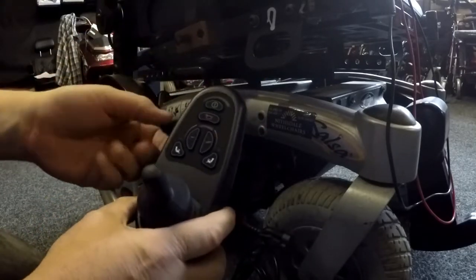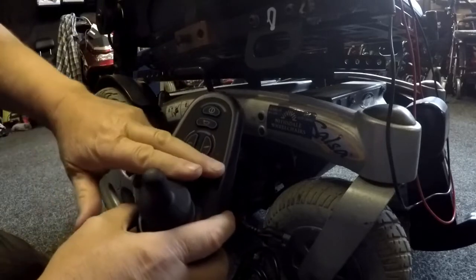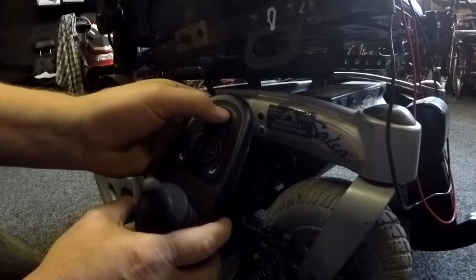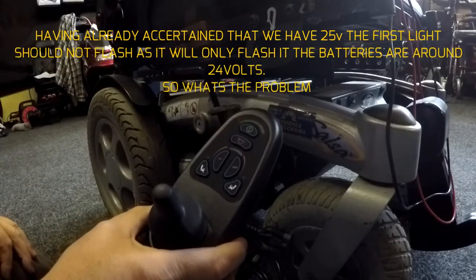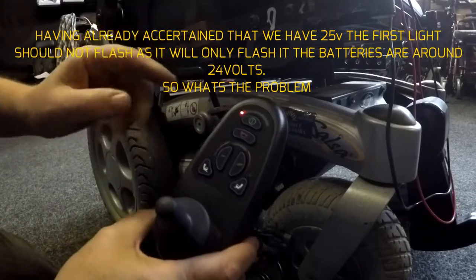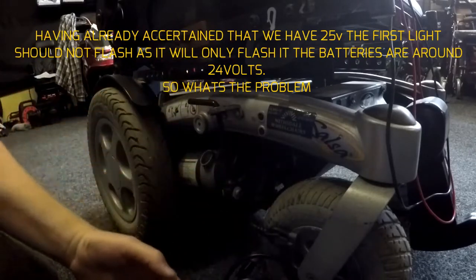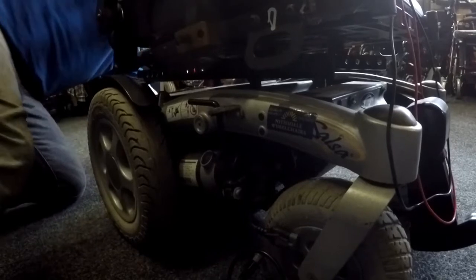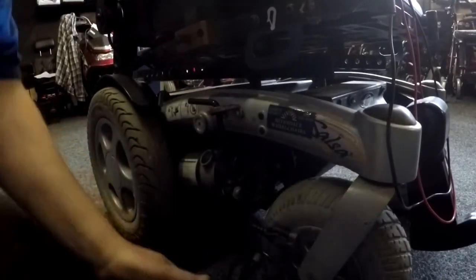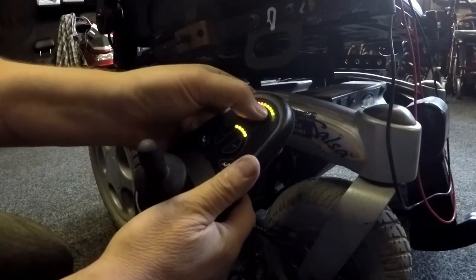We've got our VR2 here, so that's your seat riser function, this particular one. So we'll press it on, see what happens. Okay, it comes on, one flashing light, low battery power. But what I'm going to do here is put it in drive. That's it in drive now. Switch it off and on again.